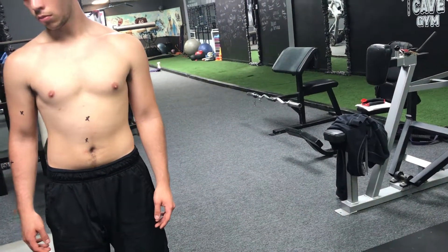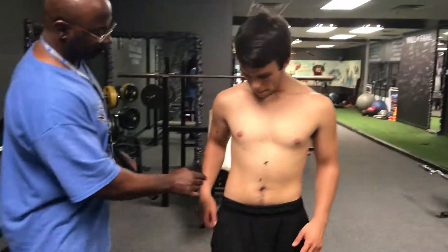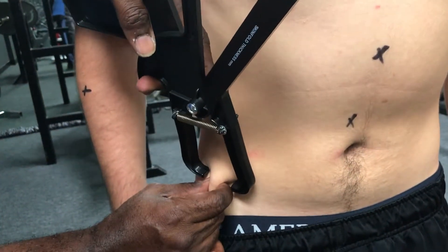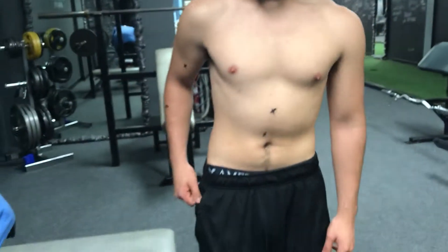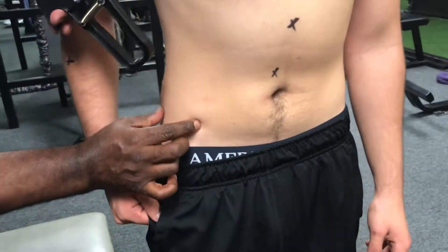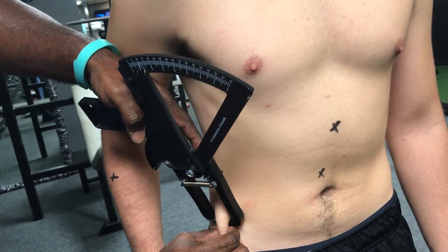Next is the suprailiac — that's on top of the iliac crest, basically on top of your hip bone. I'm going to take it right here. That's 10. And the second reading is 11.